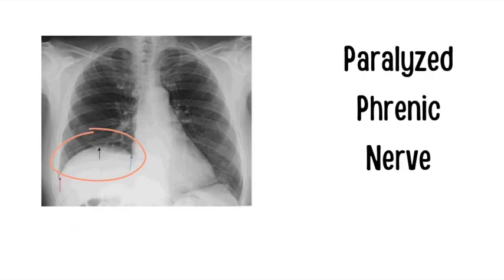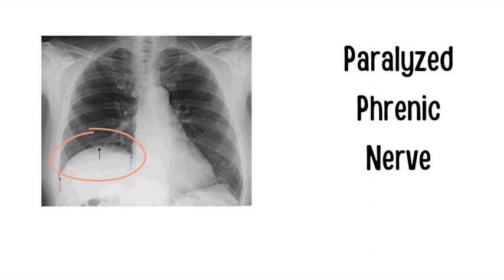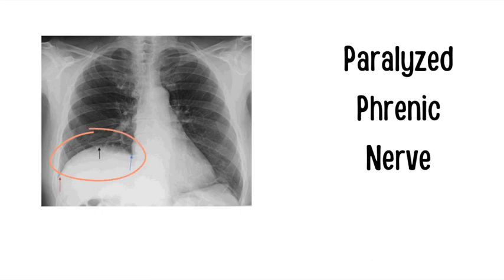Looking at this image, you can see the hemidiaphragm is elevated. One cause of an elevated hemidiaphragm is a paralyzed phrenic nerve, which can occur due to a Pancoast tumor. Recall that C5 keeps the diaphragm alive and can be affected by a Pancoast tumor. Horner syndrome occurs when C8 to T1 is affected.